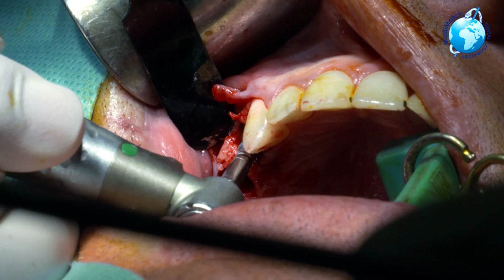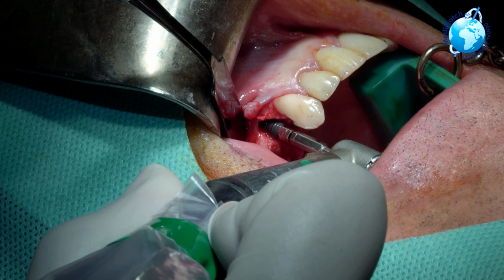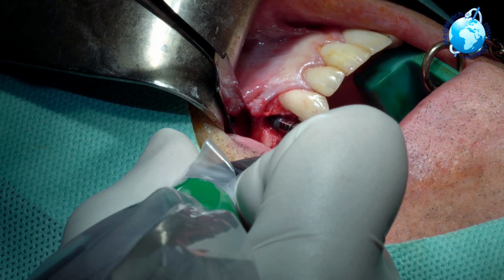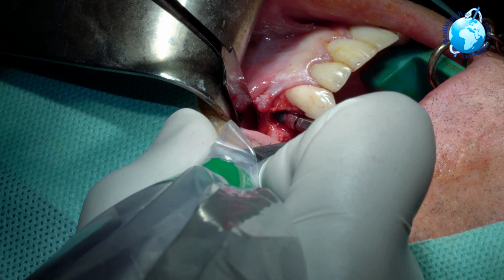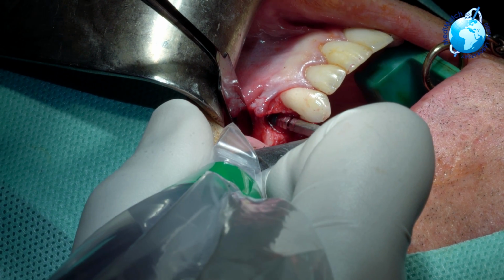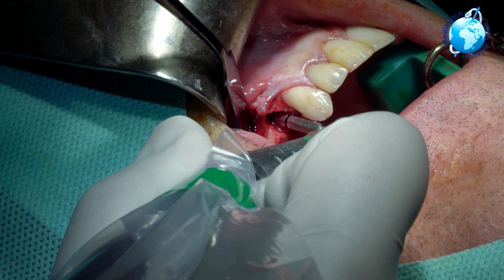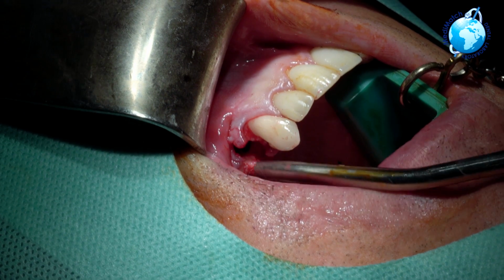You can see there the numbers: 3, 4, 7, 8, 12, 13, 19, 21, 25, 29, 32, 35, 44, 47, 49, indicated torque at 52 Newton centimeters.